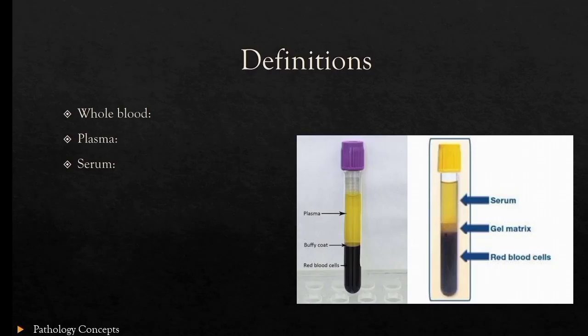Some factors like platelets and coagulation factors are activated when the blood vessels are punctured. The clotting will continue in vitro if the sample container does not contain anticoagulant.